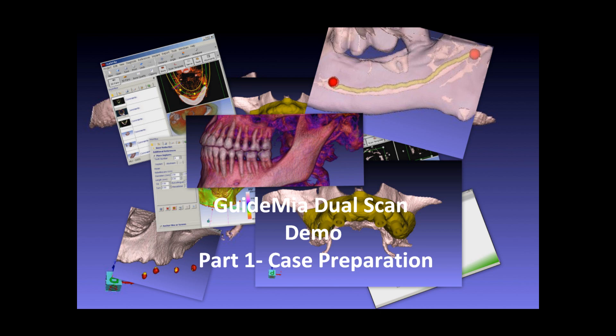By dual scan, we mean that the patient is CT scanned wearing a radiographic guide, and then the guide itself is scanned. In the case preparation, we will register the two scans, segment the bone structure, create a radiographic model, and then track the nerve channels.